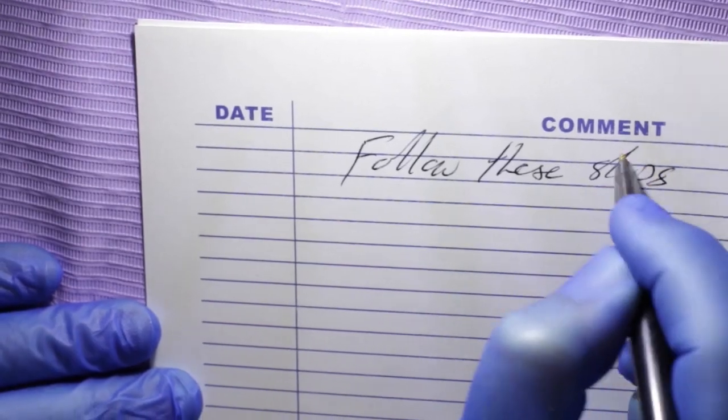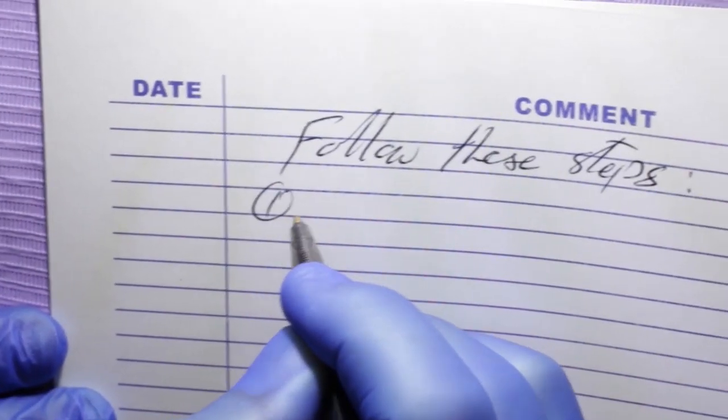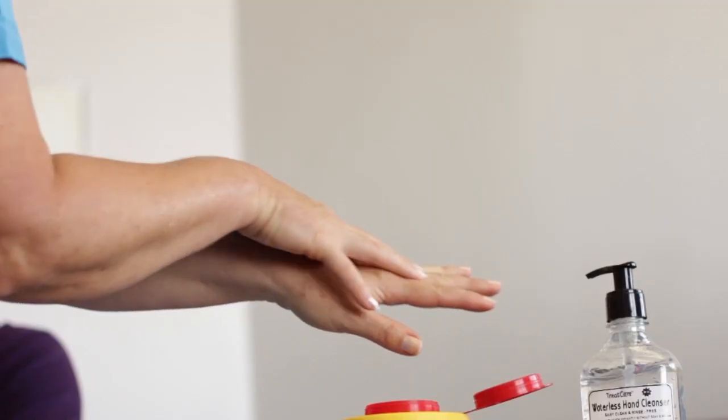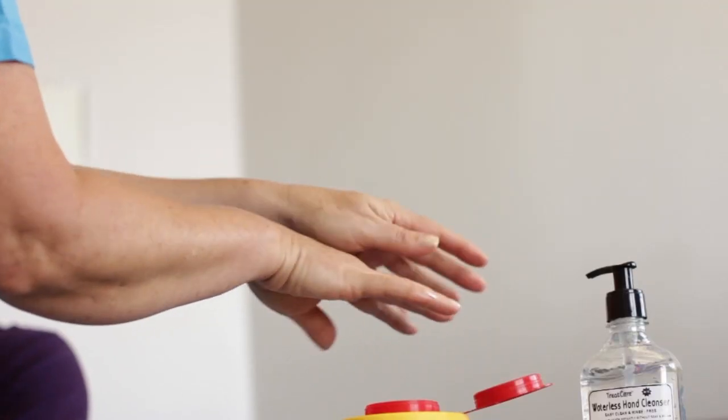Follow these steps to don clean gloves. Hygienically prepare your hands by washing them with soap and water or by applying an alcohol-based antiseptic hand rub.